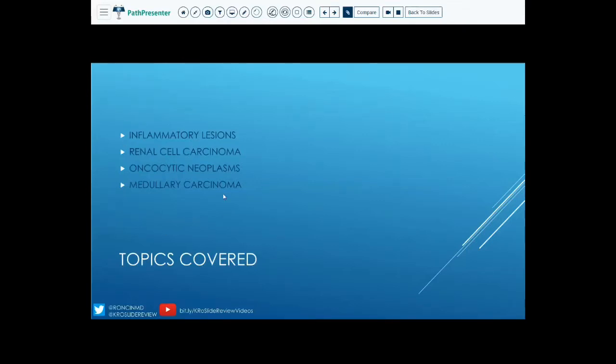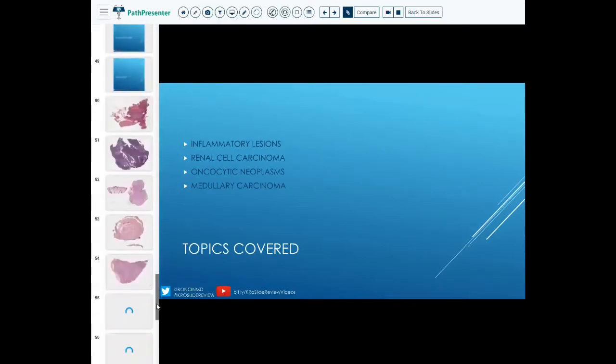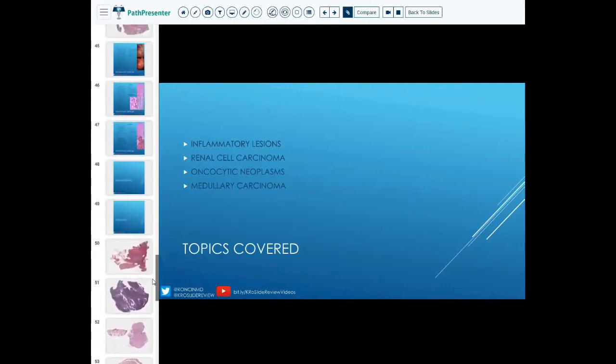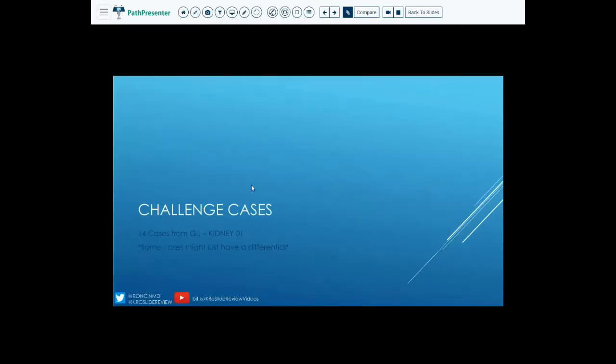So again, these are the lecture topics, so we're not going to go over the lecture topics. We're just going to head straight to the challenge cases. All right, so not a lot of them today. Okay, so we have 14 cases from kidney 1, and let's get started.